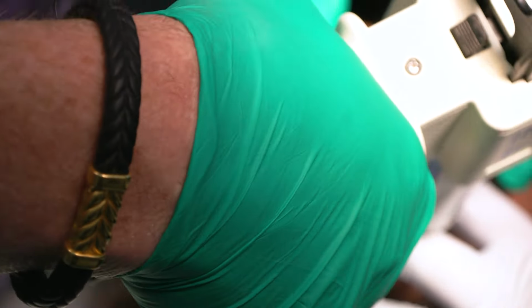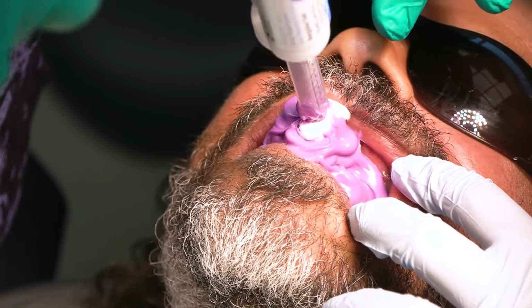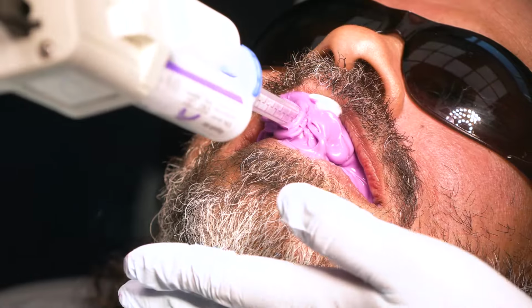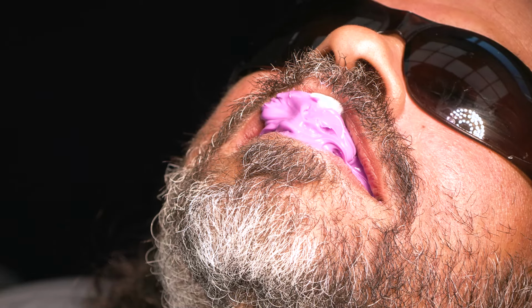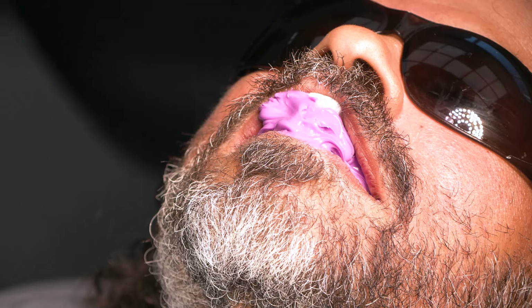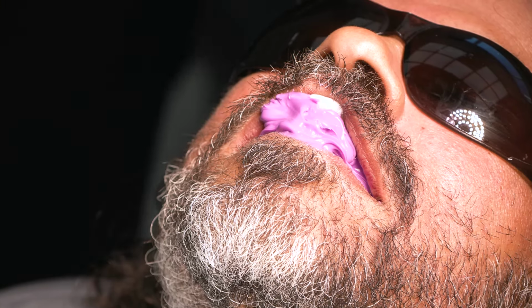Two cotton rolls tends to be pretty darn close and helps you get a good bite. Keep biting right there. Okay? Keep biting. One minute, stay still. That should be good. You can reline that with the Futar. Sure. All right, and then I do a final impression? Yep.